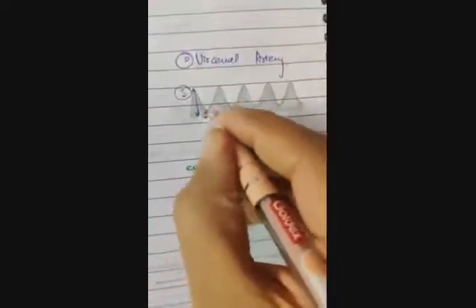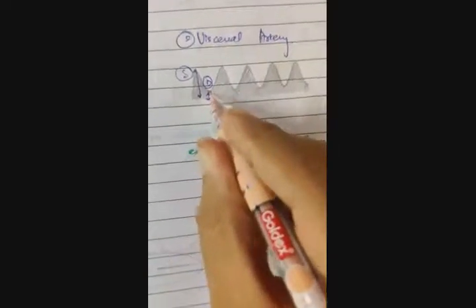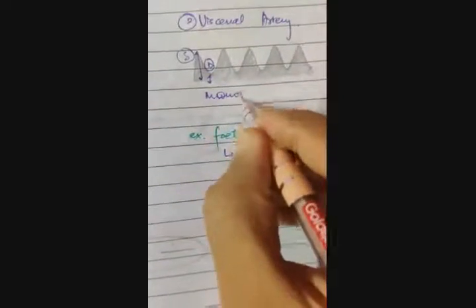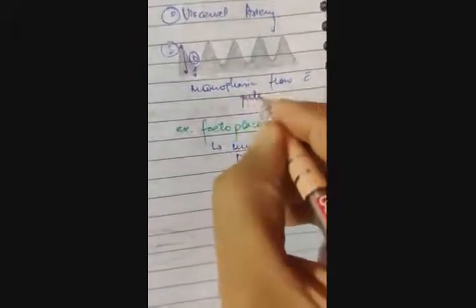Coming to the visceral artery, what you see here, this is the systolic flow. This here is the diastolic flow. All right. What you see is that the diastole never goes beneath the baseline, which is why this is a monophasic flow with pulsations. Like a sawtooth. Just to cover this topic, let me also tell you about the venous flow.